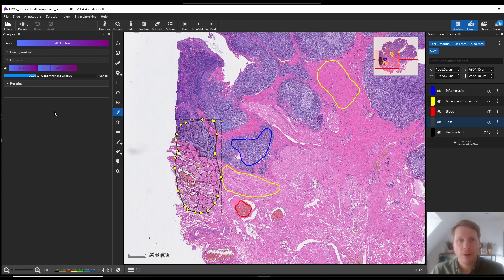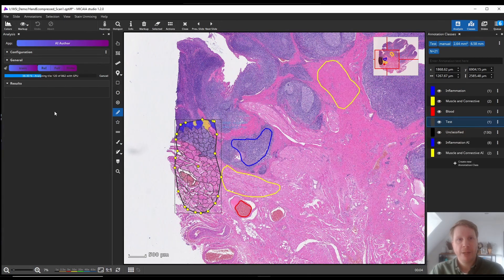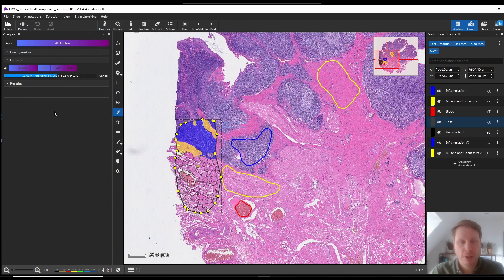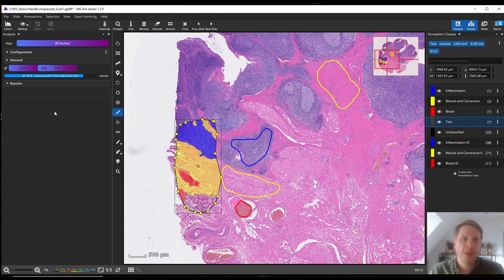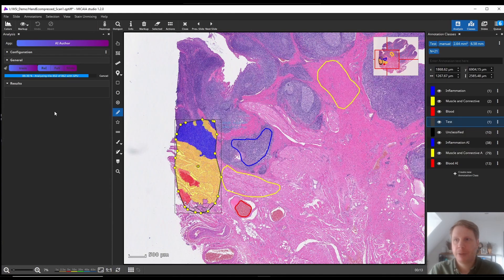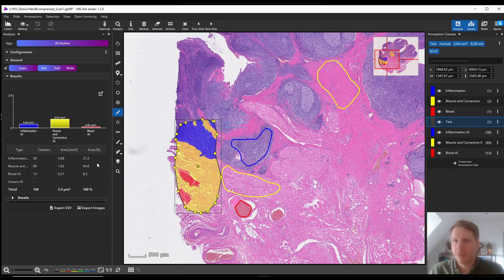You can see how this region first gets pre-clustered. It's a trick because since we work with patches and the tissue really looks like a checkerboard, it's good for both the accuracy and the performance to do this pre-clustering.